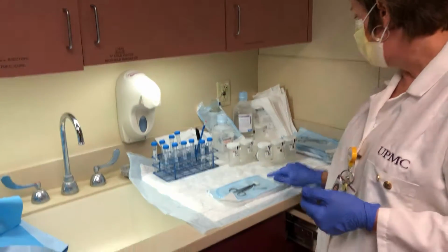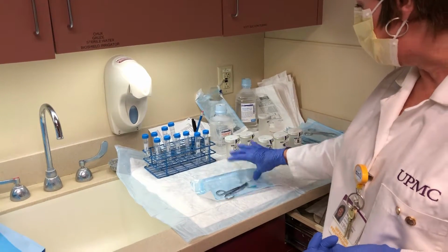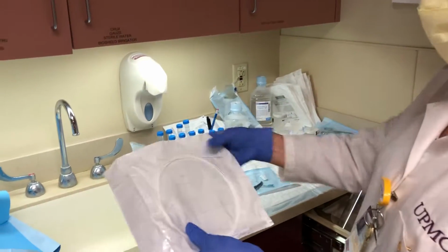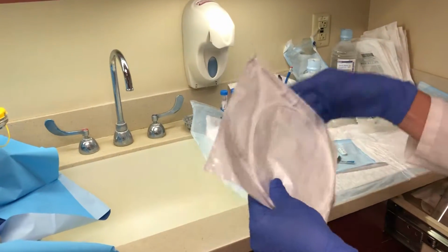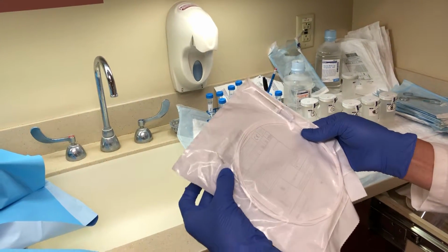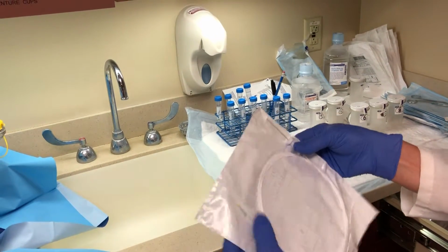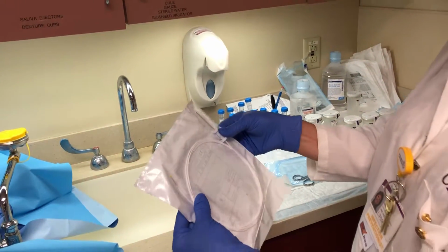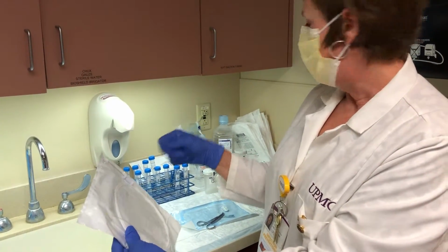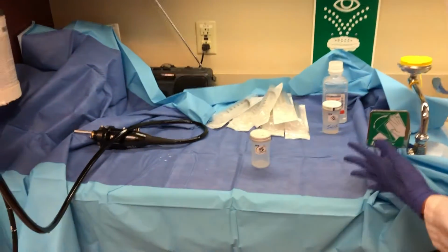We've got sterile wire cutting scissors that we're going to keep sterile. We have endoscopy coiled brushes that we will use that are sterile, and we specifically use the smaller end of the brush, but you can use the larger brush if you have a channel or a port that you want to do further scrubbing with. And then this we have set up on a sterile field.